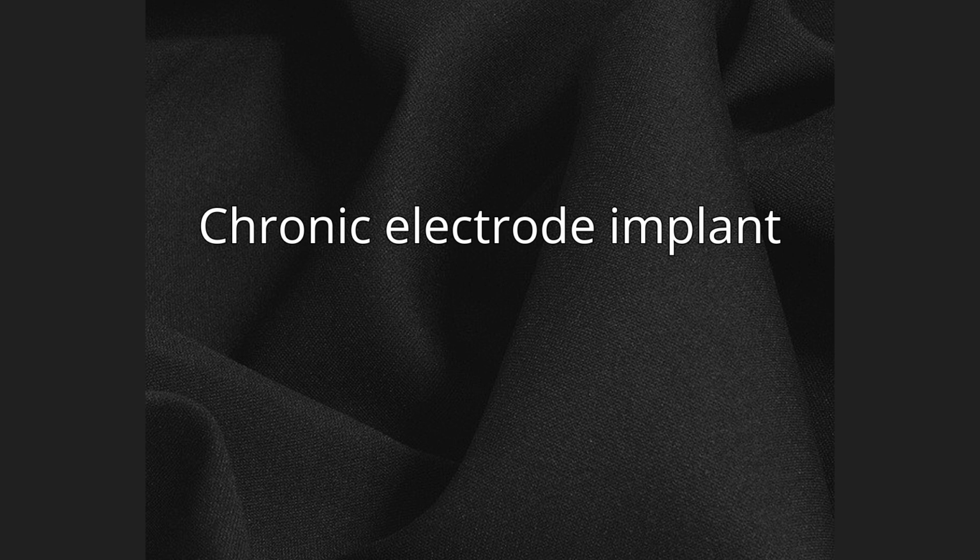Chronic electrode implant. A chronic electrode implant is an electronic device implanted chronically, for a long period, into the brain or other electrically excitable tissue. It may record electrical impulses in the brain or may stimulate neurons with electrical impulses from an external source.